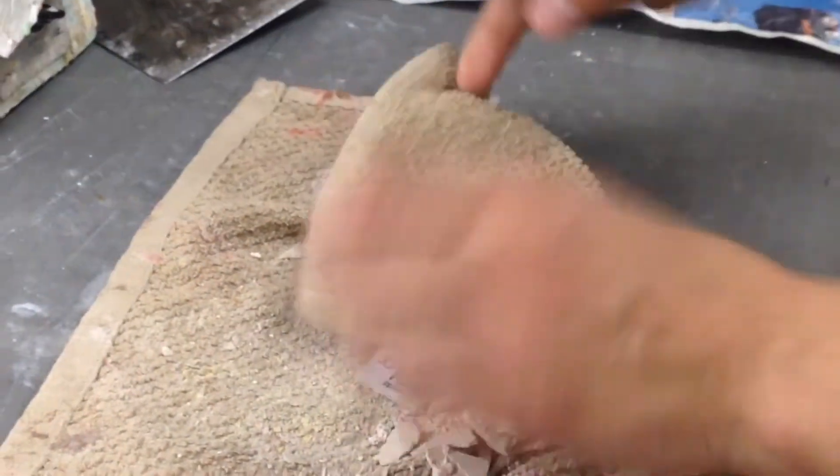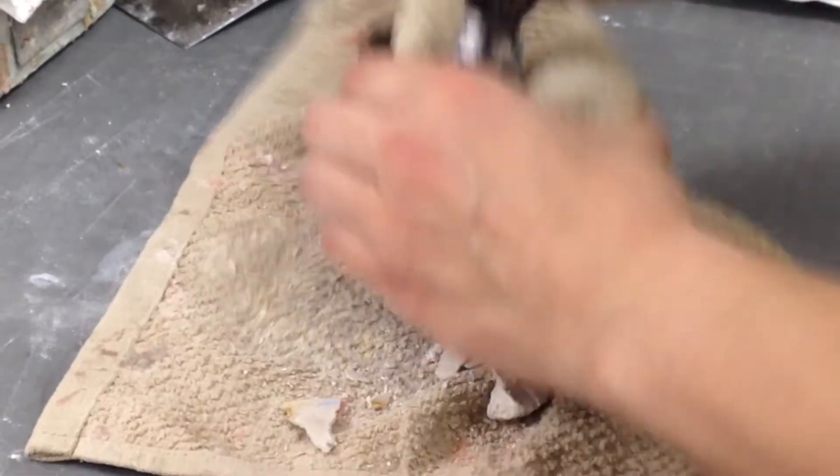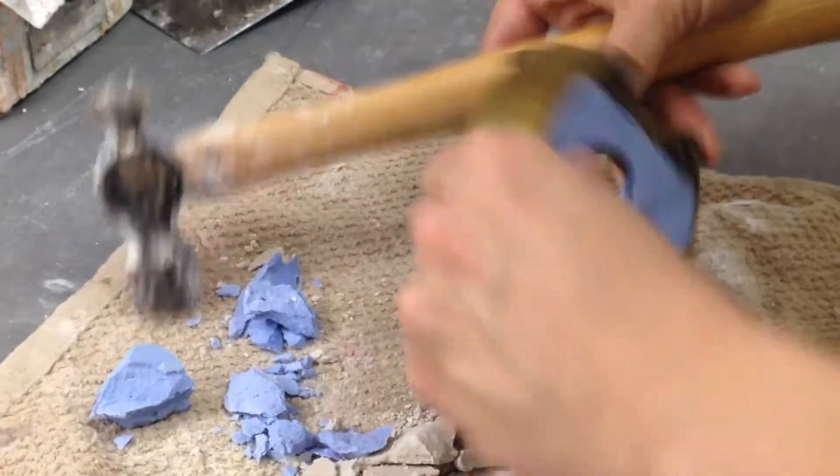This process may seem faster, but if care is not taken, you run a high risk of damaging the denture base or denture teeth.